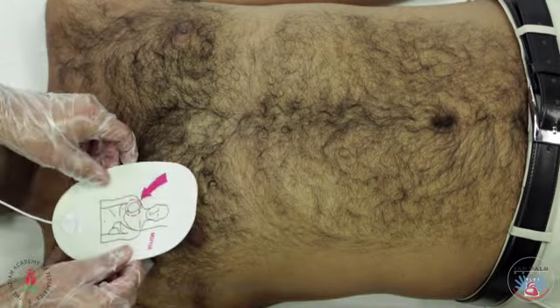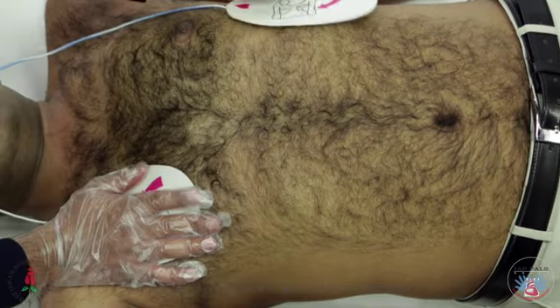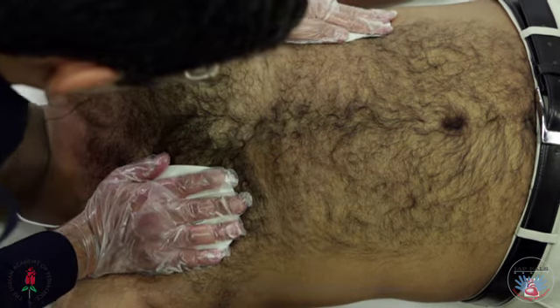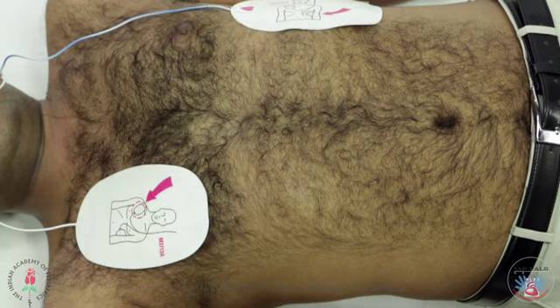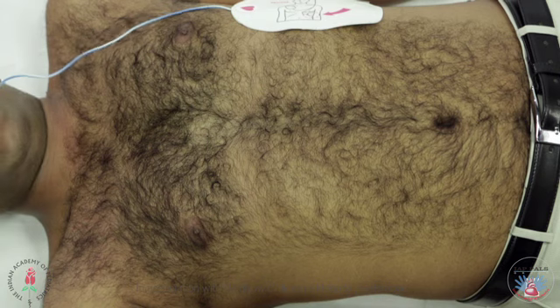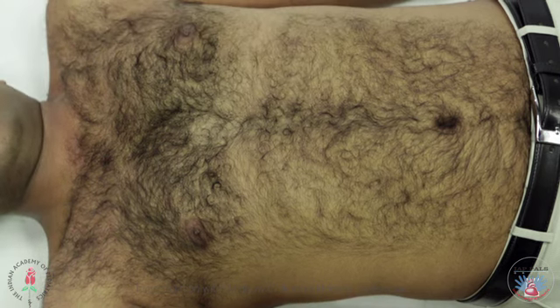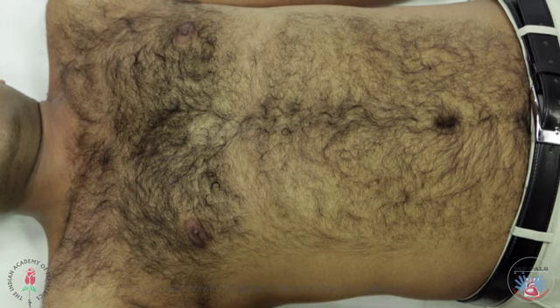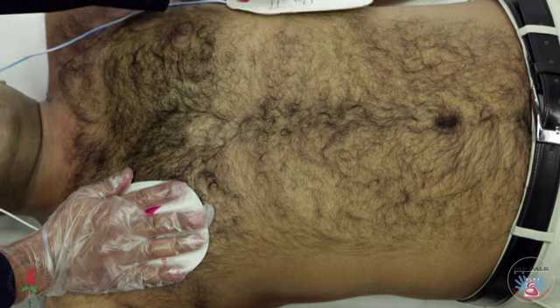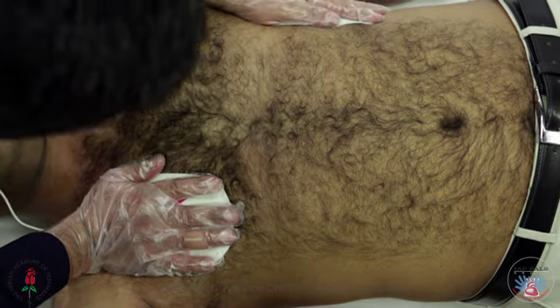When the victim has hair on his chest, the hair may prevent pads from sticking. The AED may tell you to check pads, and if this happens, press the pads down more firmly. If they are still not sticking, rip the pads off forcefully, removing the chest hair. Then reapply a new set of pads to the bare skin. If your AED supply kit has a razor, use it to shave the area, then reapply a new set of pads.